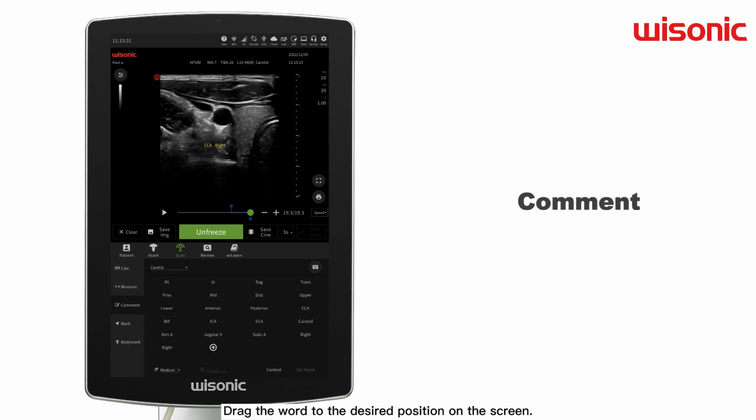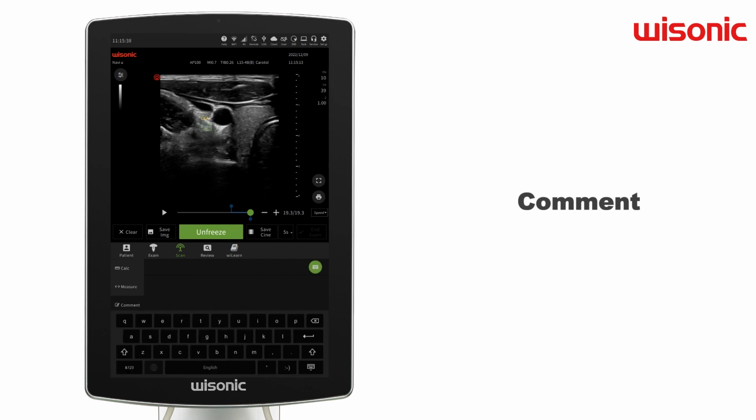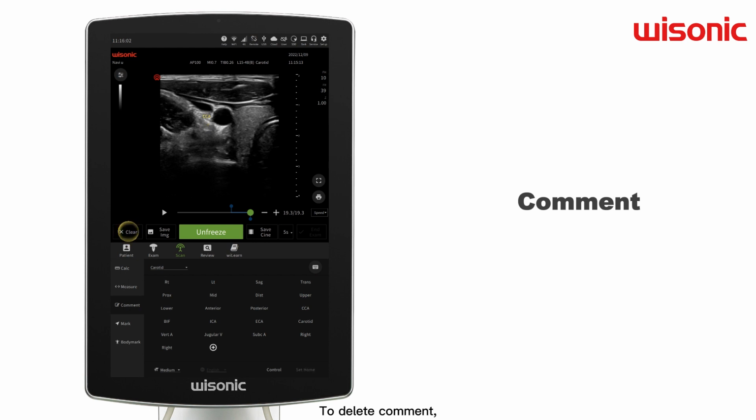Drag the words to the desired position on the screen. Tap on the word to edit. To delete comment, click Clear to delete the last added comment, or long press Clear to delete all the comments.